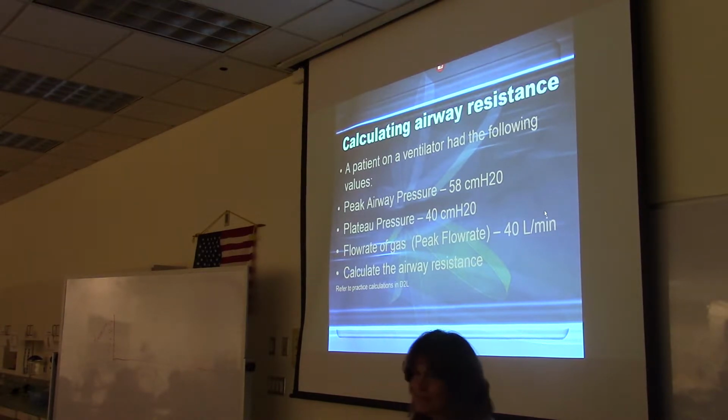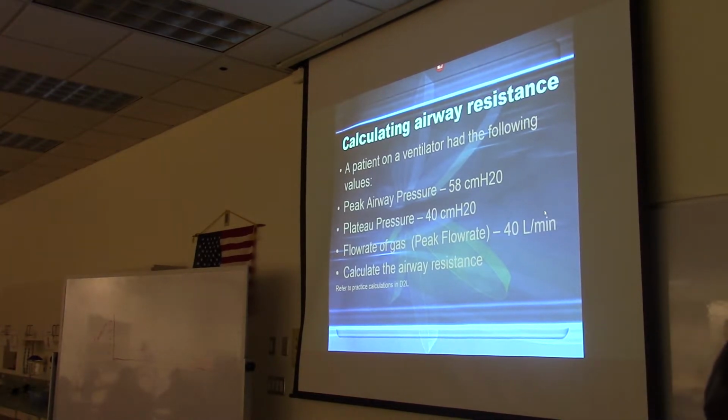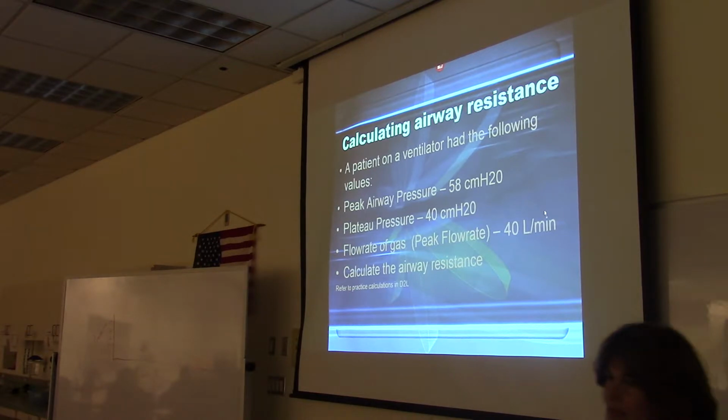All right, everybody's got that? What is the units? Pressure over flow, so centimeters of water per liter per second. You multiplied by 60, right? Yeah, liters per second.